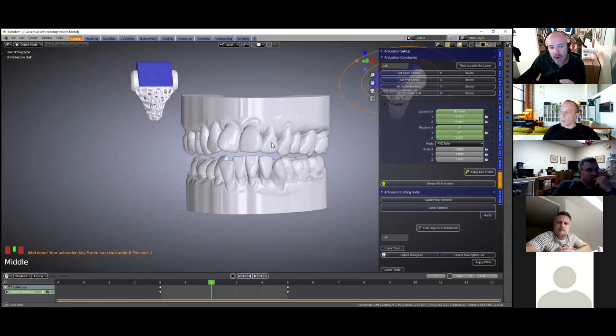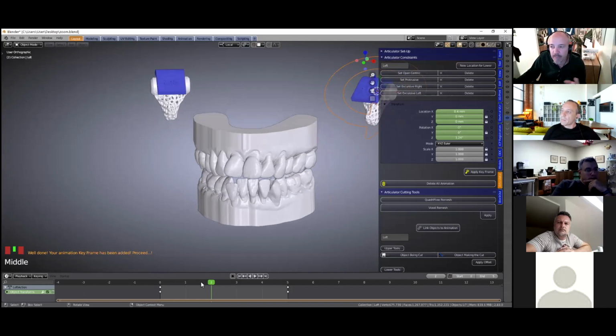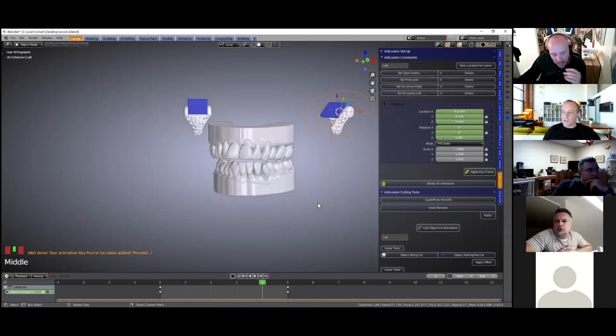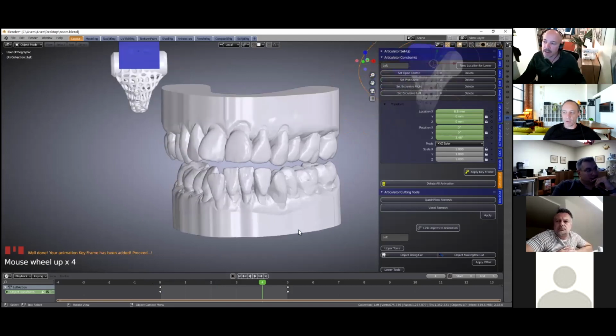Are there any questions with the articulator so far? Because we've basically finished our animation for the articulator. I think I've unmuted everybody, but otherwise, just type in the chat box, and I can relay the question to Michael.